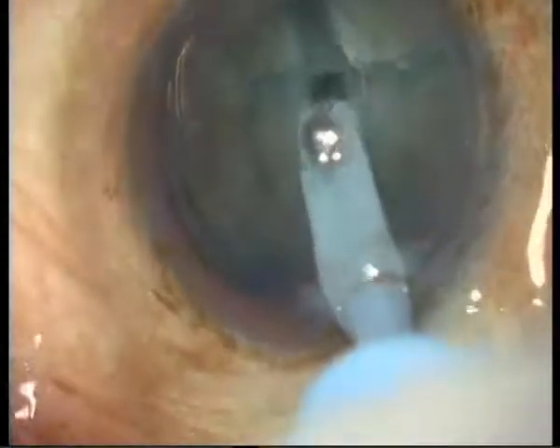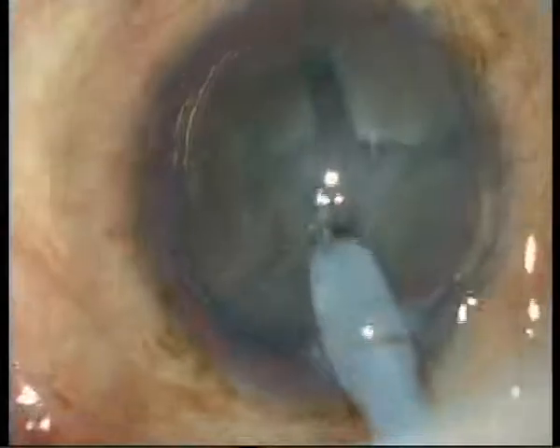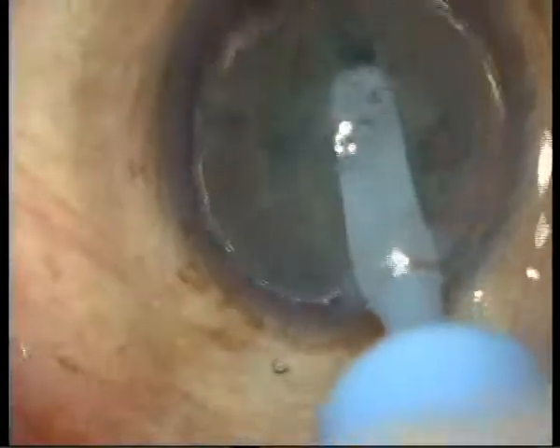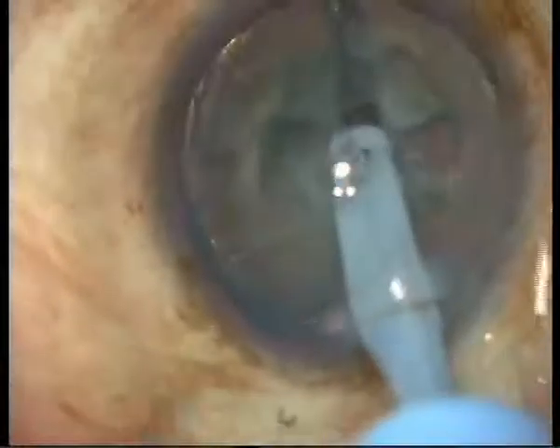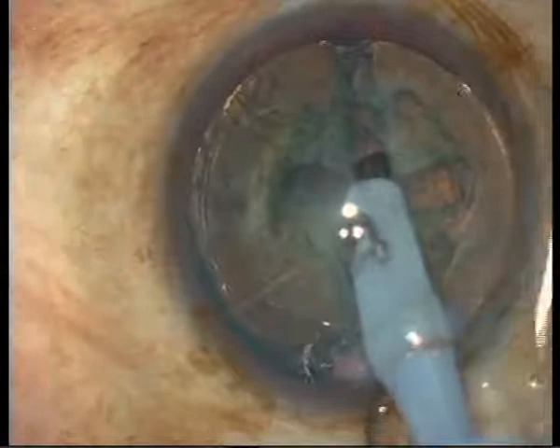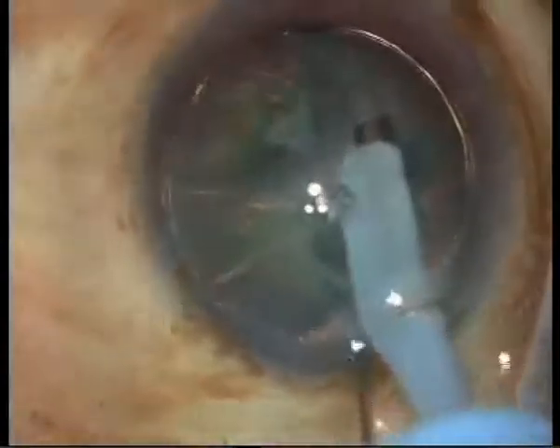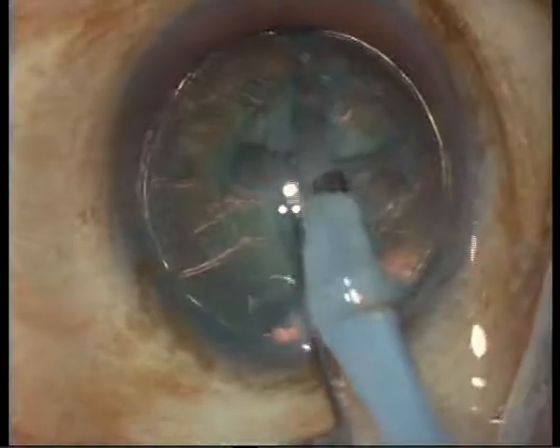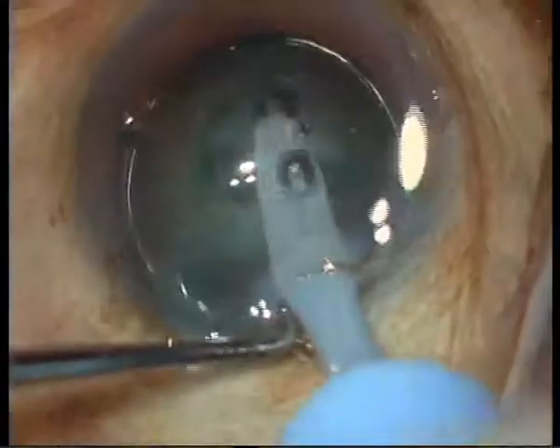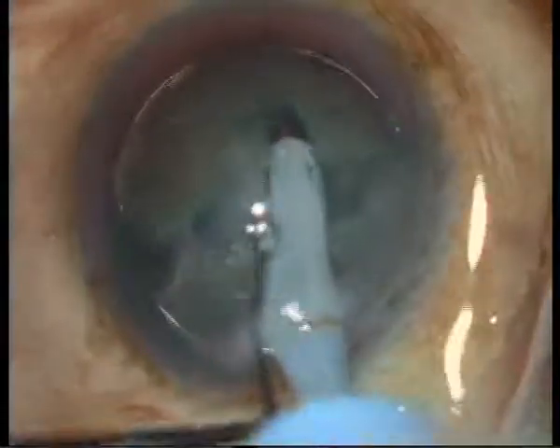That's enough. This is the technique that I'm still teaching to my residents, and also using the caliper. This is also a technique I teach my residents, because they have to know. I regularly point out how important it is to be very accurate in the sizing of your anterior capsulorhexis.